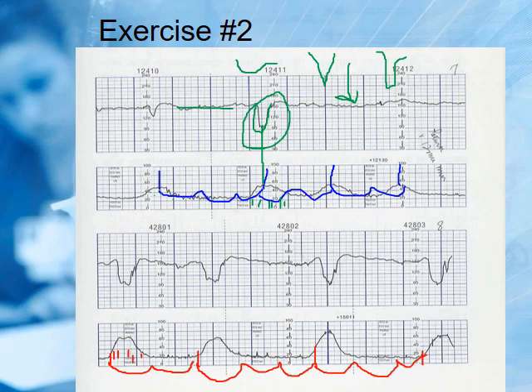And then tell me about the fetus. Baseline? About 150, right? Variability? Wiggliness? Kind of minimal. See along in here, it's not moving, not too big change.